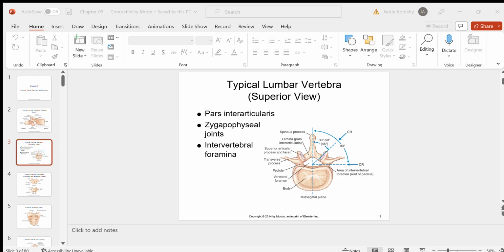If the patient is in the PA projection right now, and they were in the AP projection, what position would show that same joint? If RAO does it, and that LPO, then LPO will also do it, right? A left posterior oblique will also do it.